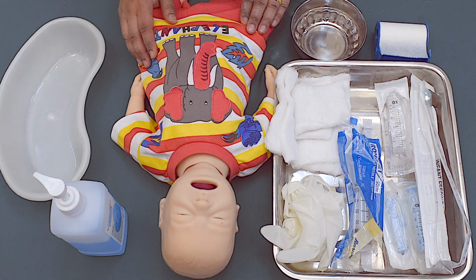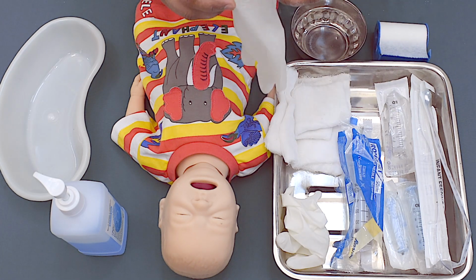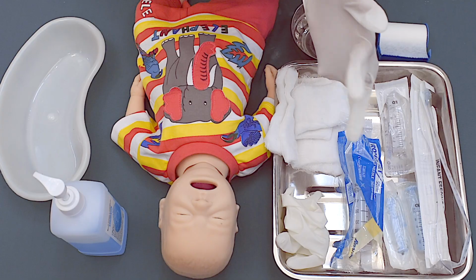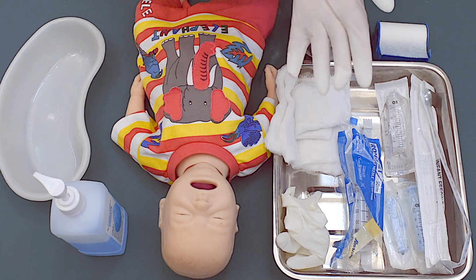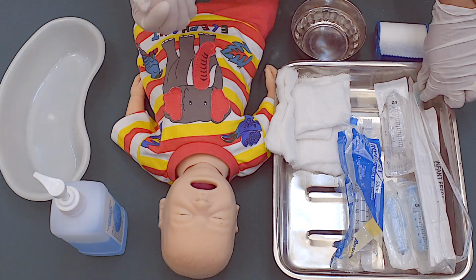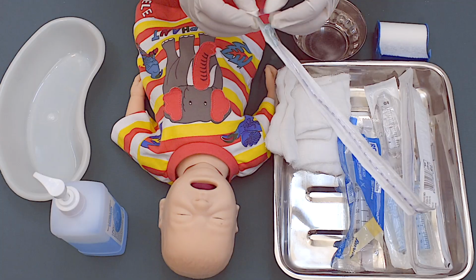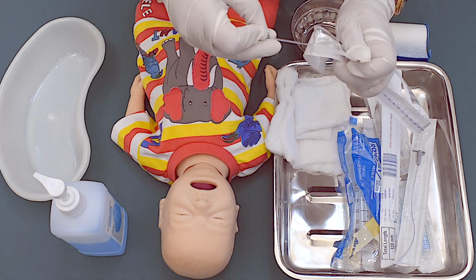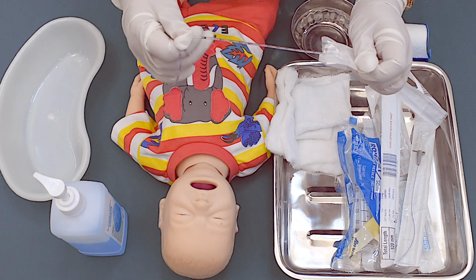To begin with the procedure, wash your hands first, wear clean gloves, take the nasogastric tube, open the tube like this, and keep the tube coiled in your working hand.